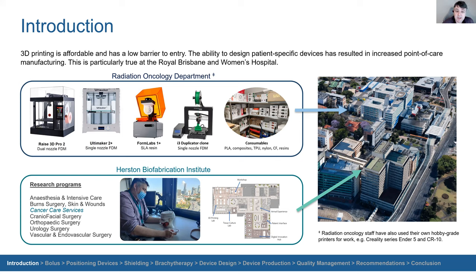And then there's a lot of patient comfort and support devices, things that are pretty similar to what's getting used in radiation oncology, things like shells for burn patients, which are very similar to immobilization masks in radiation oncology. So today I'm just going to discuss some applications of 3D printing technology for medical devices in a radiotherapy setting, share some experiences from my own department, which is the one shown here in Brisbane.